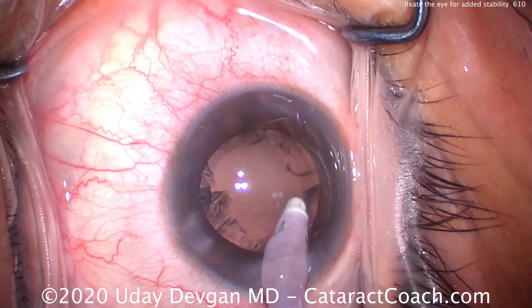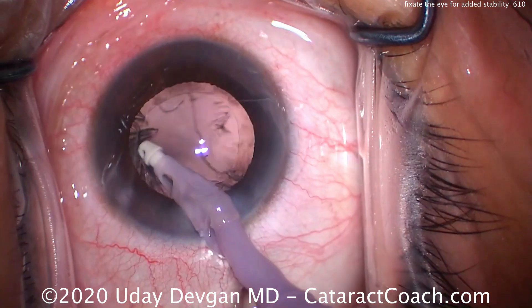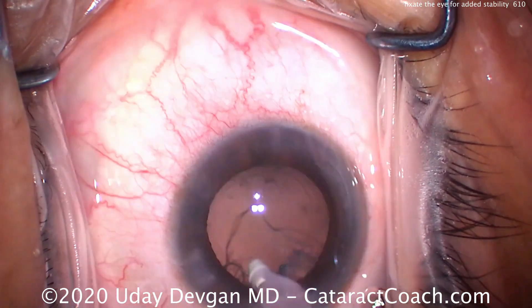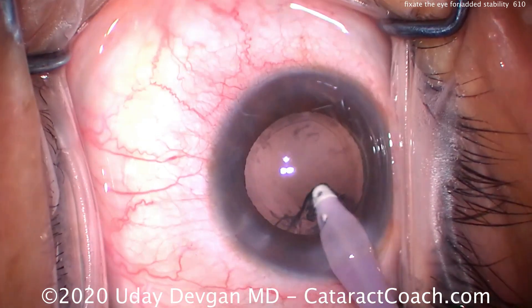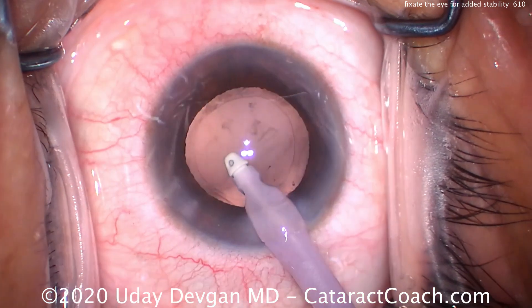So hang in there, take your time, be a very safe surgeon, and help the patient out as best you can. There's the fishing-up cortex removal. My technician is loading the lens for me to just minimize the amount of time we have to be inside the eye operating.